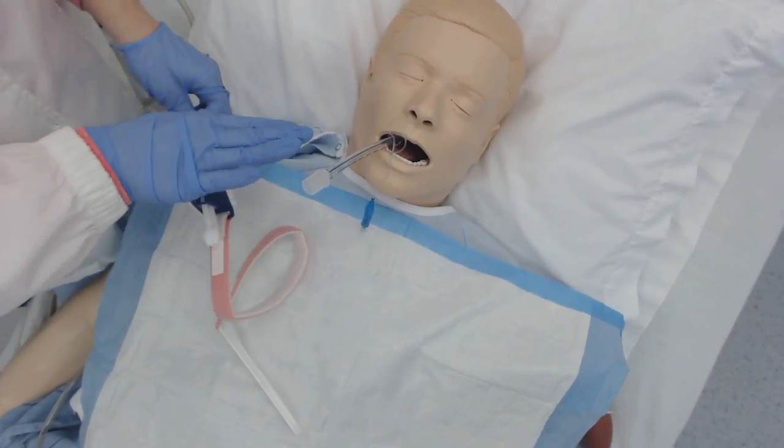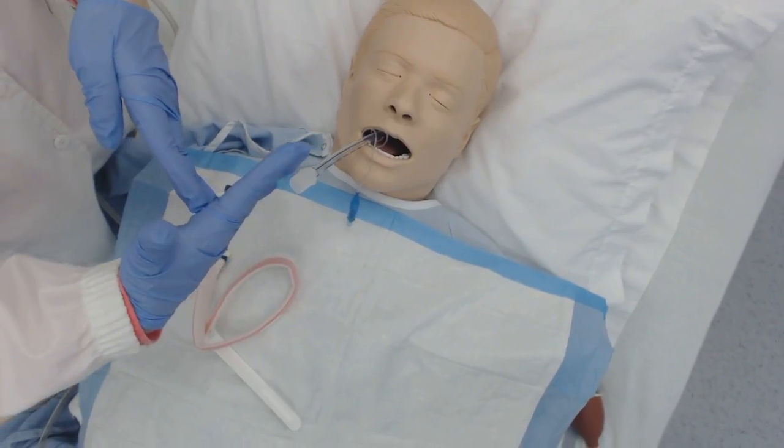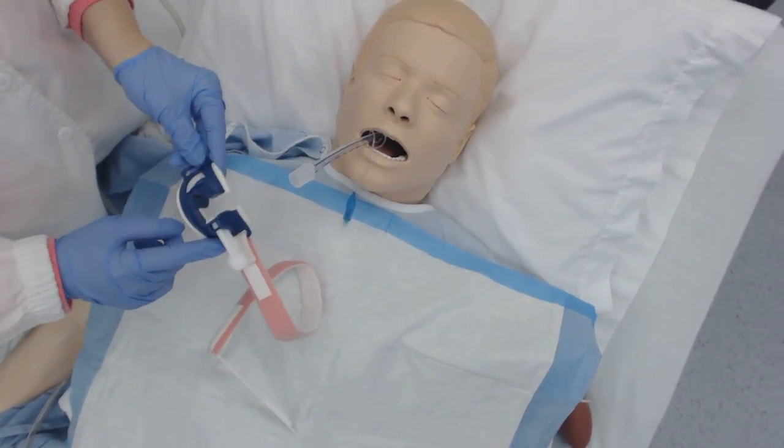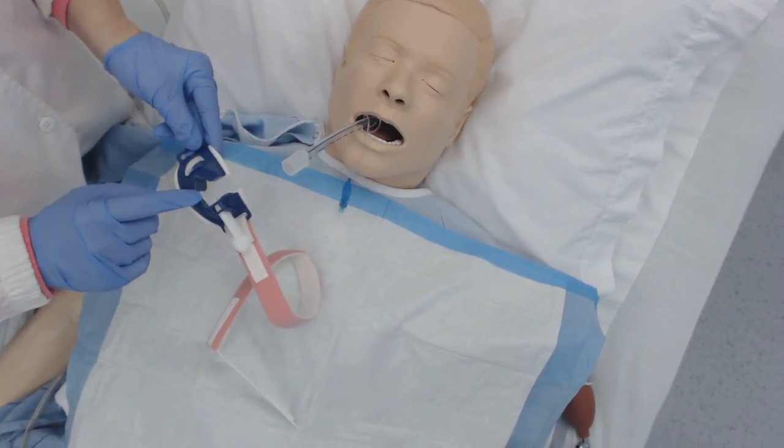Your patient has just been intubated and now we're taking a time out. I'm going to show you a couple things. This is an ET tube holder — it's very similar to a trach holder.